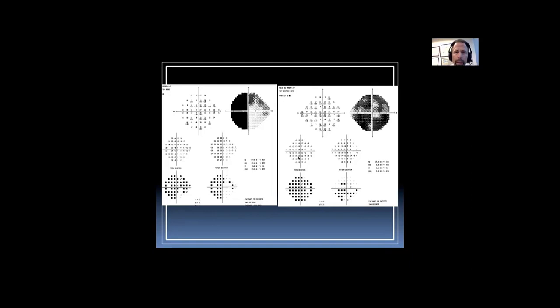Is it recommended to do a visual field on a patient whose pupils have been pharmacologically dilated? So I don't typically dilate pupils. You can, as long as you give them the right correction, taking into account that you've paralyzed their accommodation. Some of my partners often do them dilated. I don't do them dilated unless the pupils are really tiny. So if the pupils are like 1 millimeter, 1.5, maybe 2 millimeters, I might dilate the pupils.